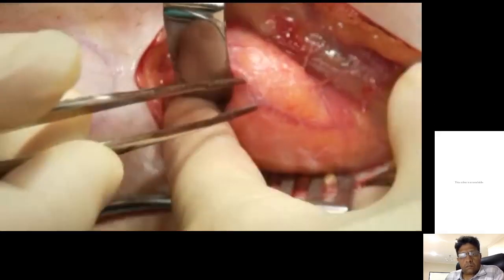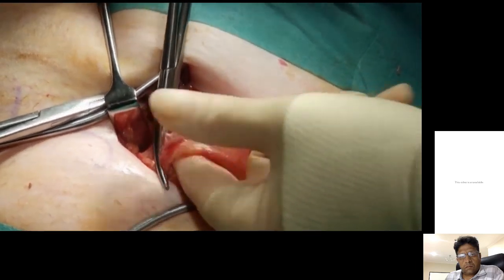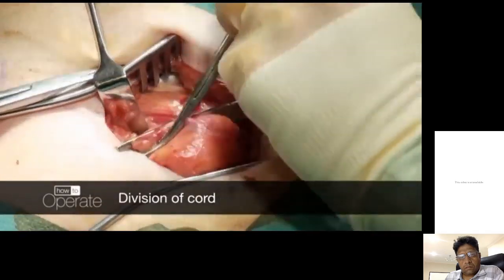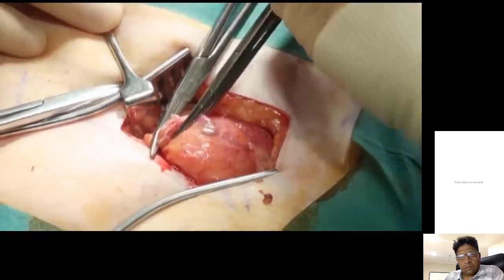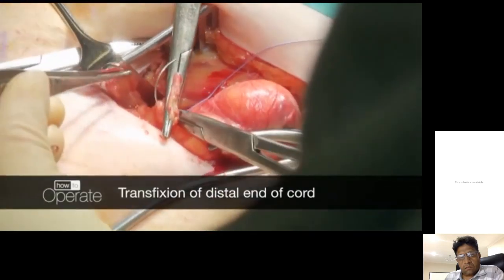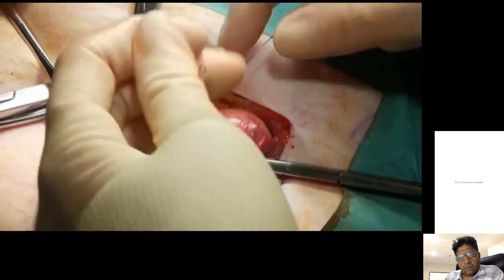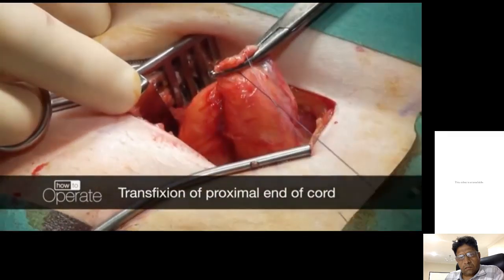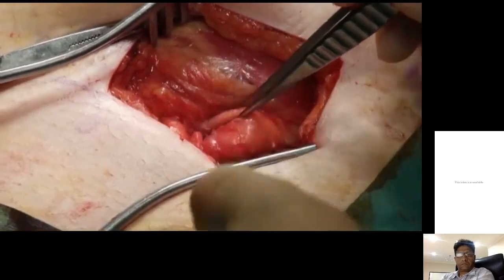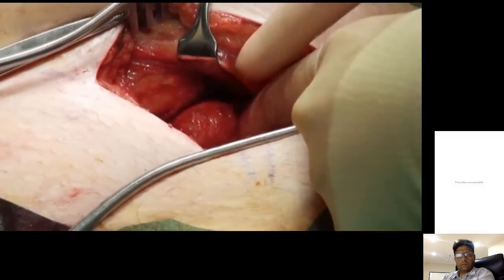Hernia sac. So we've got the pubic tubercle from this direction. Now you really need to get to it from above as well. I do a continuous plication starting usually. I'll try and hold it in. Yeah, full length. Let's do it a full length.